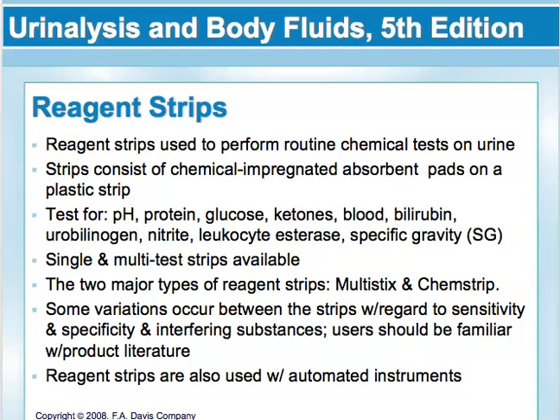Single and multi-test strips are available, so most labs are going to use the multi-test strips and provide results for all of the parameters that I mentioned just a minute ago. Some specialty labs, or maybe even the emergency department, may have just single test strips available.